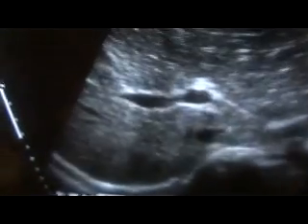This is the inferior vena cava in transverse section. These are minor portal vein radicals, these white structures. In kids, you may see them and it is not pathological.